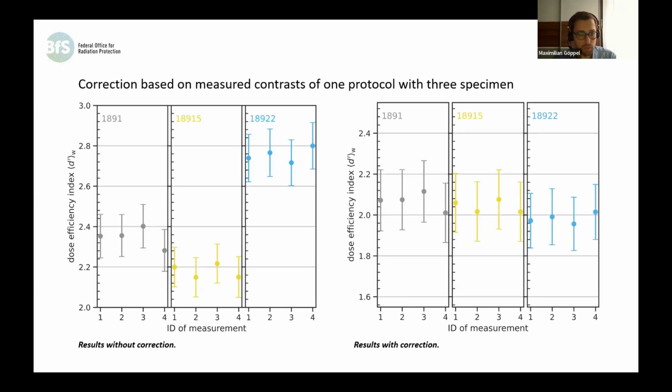And from the left, where the differences were up to 30%, we reduced them to below 8% on the right. We also found the same results for the phantom CCT191, which is another type with slightly different specifications, and those are not shown here.